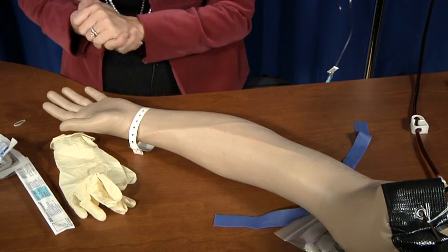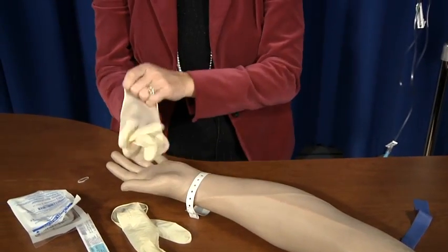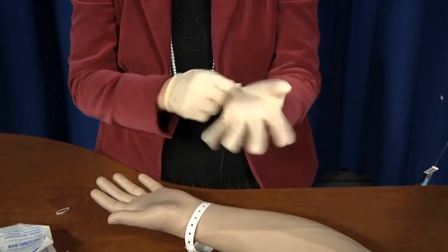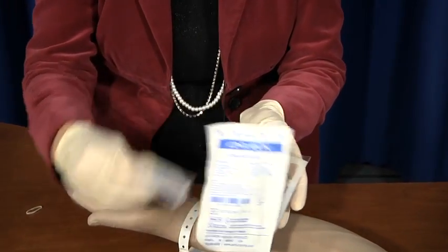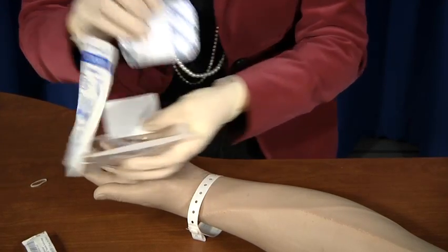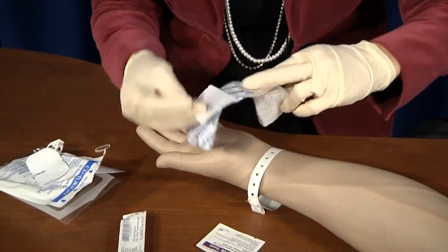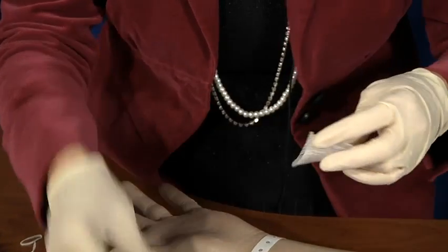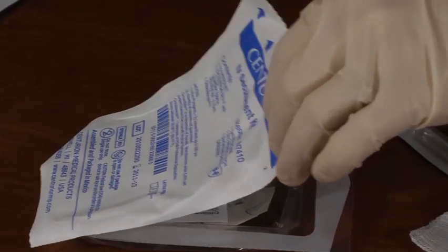Now we're going to wash our hands or use hand sanitizer. We're going to put our gloves on. We're going to get our equipment out. And what you'll find in these packs, they're all different depending on your hospital. You should have an op site, and they all look relatively different. You should see an op site, you should have something to clean with, and you should have some tape to secure the site.